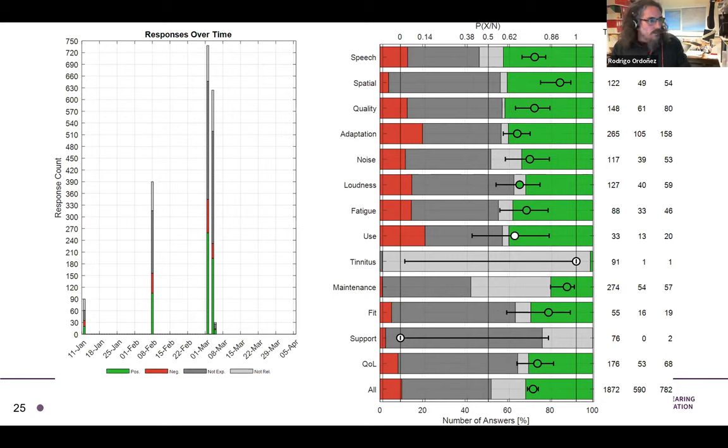And of course, here's another person that suddenly out of nowhere thought, oh, I have to do this, and then spent 2 days answering back and forth. So if a subject uses the system in this way, then the ratings that we see in these 2 days are probably not representative of the entire month or 2 months. So this is actually just to say that this wouldn't be a very good data set, or you would have to actually be very careful in the interpretation of these results.